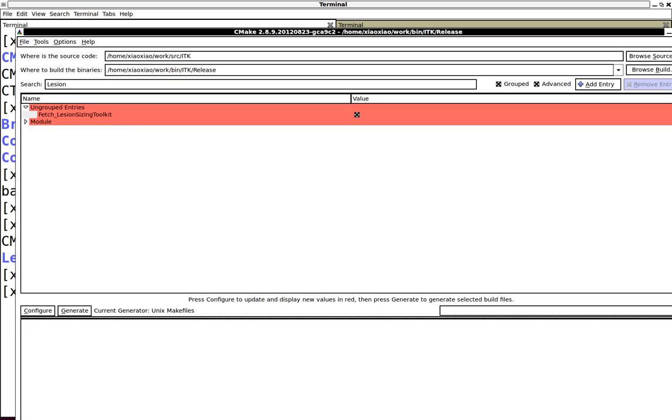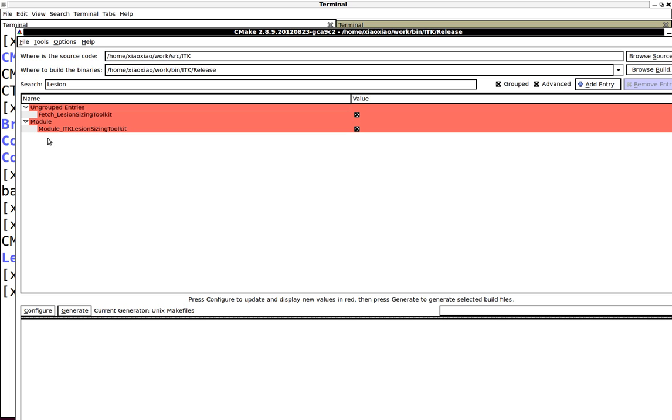After you enable this and get the source code, there is a new CMake variable called Module_ITKLesionSizingToolkit. Make sure you turn on this to include this module into your build system.